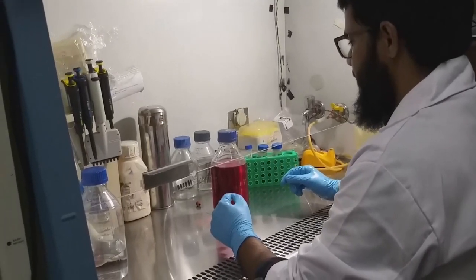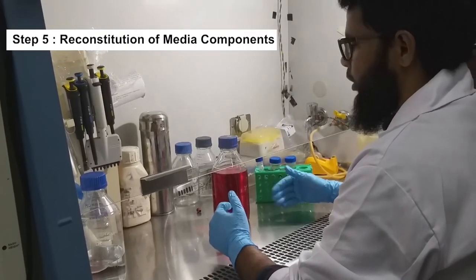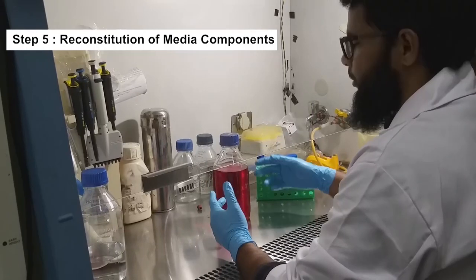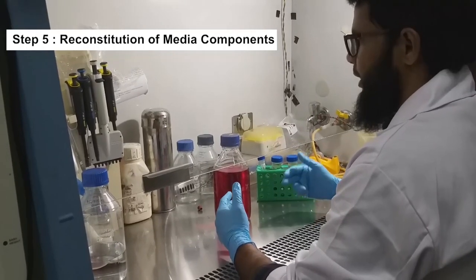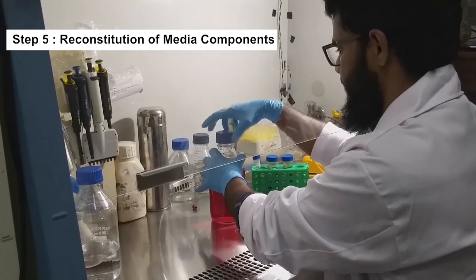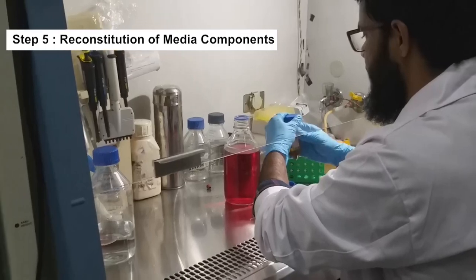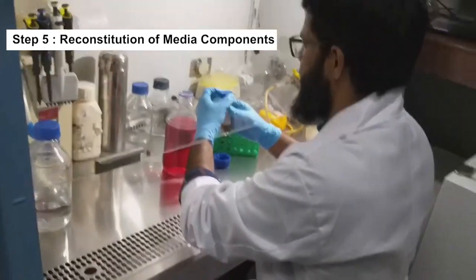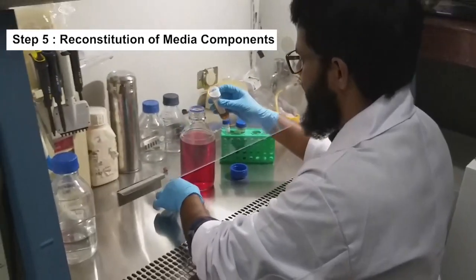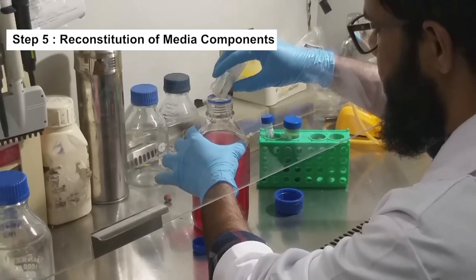After the media has been filtered, we now need to add FBS and antibiotic in order to make it complete media. The complete media comprises serum, whereas the incomplete media does not contain serum. We are adding 100 ml of fetal bovine serum in order to make it 10% FBS containing media.